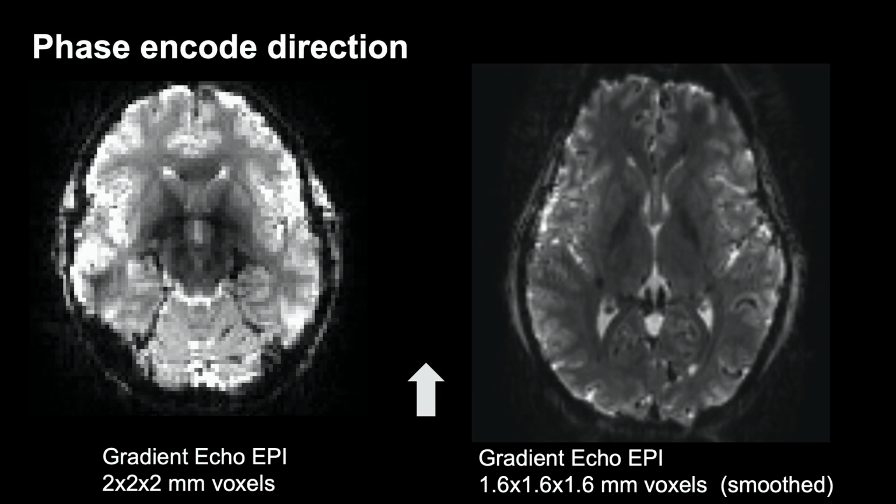This can be corrected with the alignment in something like Turbo-BrainVoyager, but the more processes you put into the data that you're sending to Turbo-BrainVoyager, the longer it's going to take to process this. And this is part of what I think a lot of people have mentioned, that you get in these delays. So the more robust your raw data is that comes off the scanner, the less chance that it's going to cause delays in the post-processing.